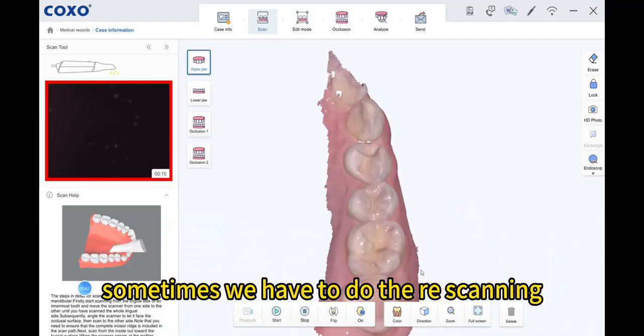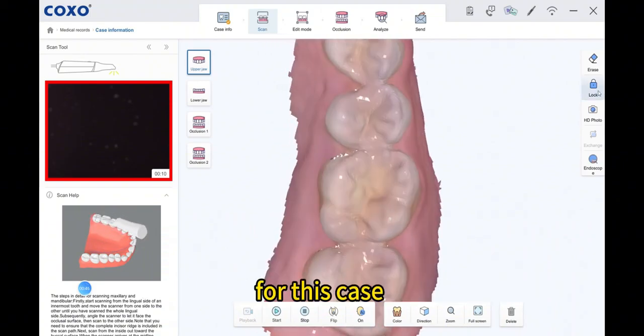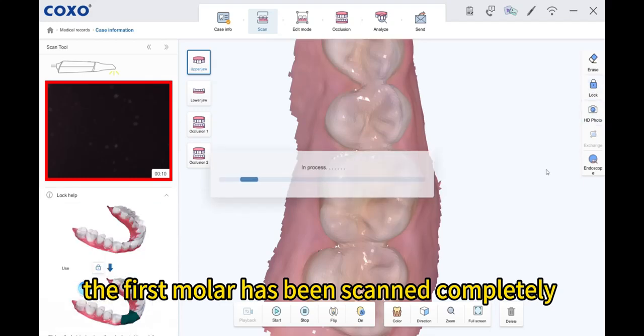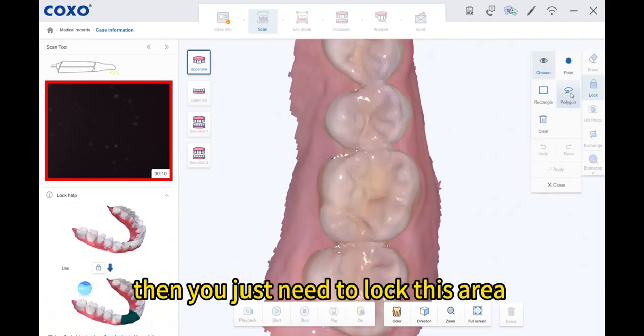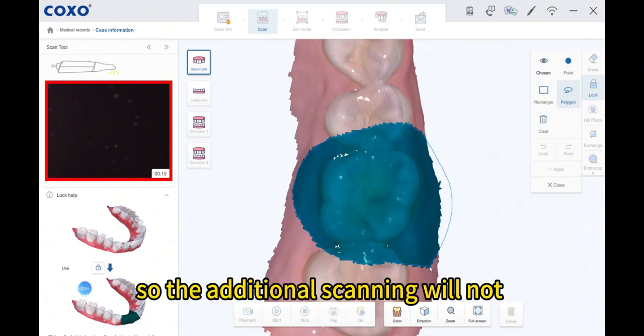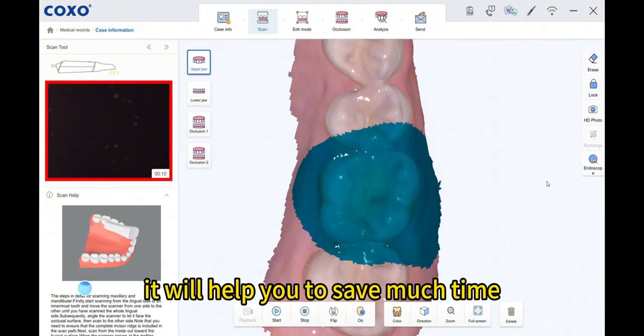Sometimes we have to do the rescanning to make sure the data is complete. For this case, the first molar has been scanned completely. Then you just need to lock this area and scan other areas, so the additional scanning will not affect the locked areas. It will help you to save much time.